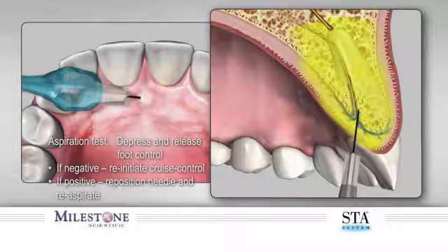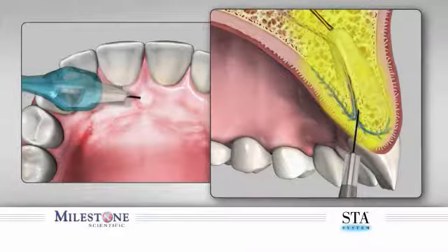If there was a positive aspiration, as determined by observing blood in the hub or tubing, reposition the needle and then reaspirate before continuing. After you have delivered the proper amount of anesthetic, you will notice diffuse blanching of the tissue. Once the suggested volume of anesthetic solution is dispensed, the needle will be removed. To avoid anesthetic sprayback during needle removal, use the following needle removal technique.